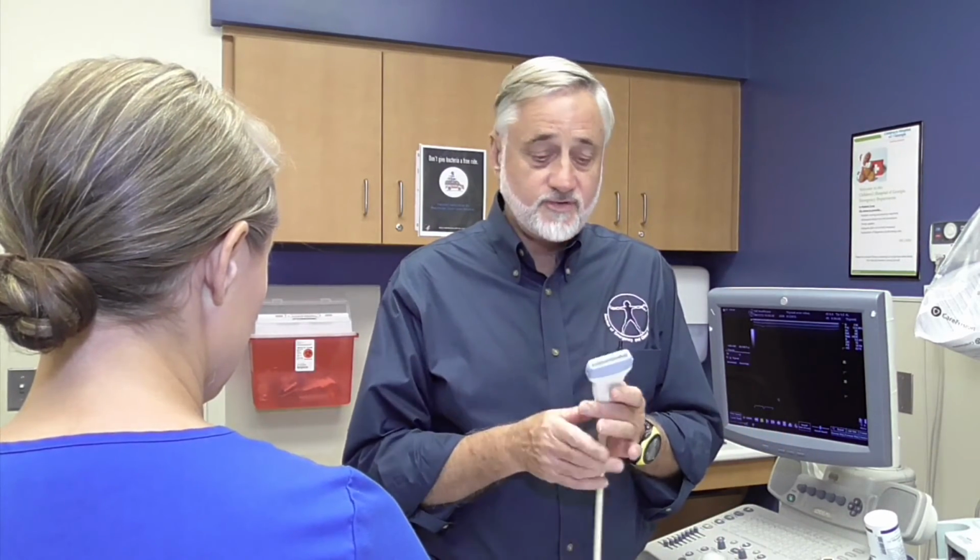This is a live scanning demonstration of the thyroid. I think before we begin, let's look at the probes. We're going to use a linear probe. They're usually 30 or 40 millimeters for the thyroid scan. These are high frequency and will give us a nice demonstration of the thyroid gland.